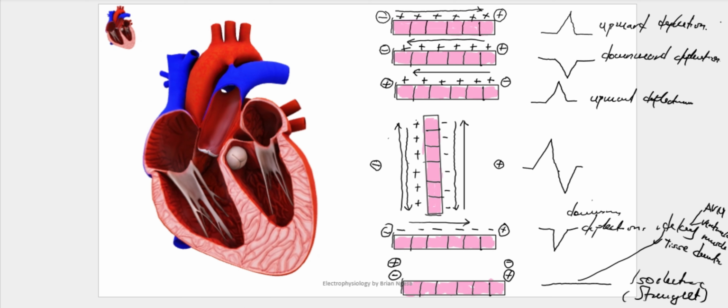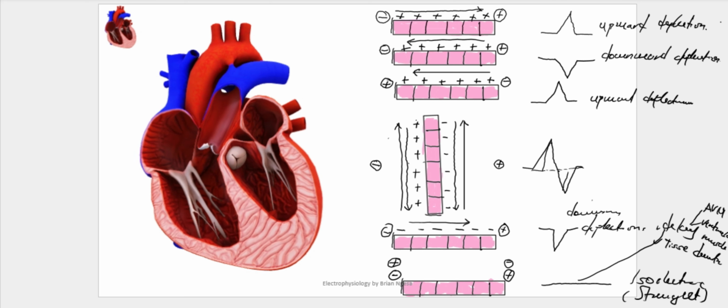So the ECG is very clever. It will not give you something like this, especially when you are having maybe similar amplitude. It is mathematically clever and it normally cancels off and gives you a straight line.